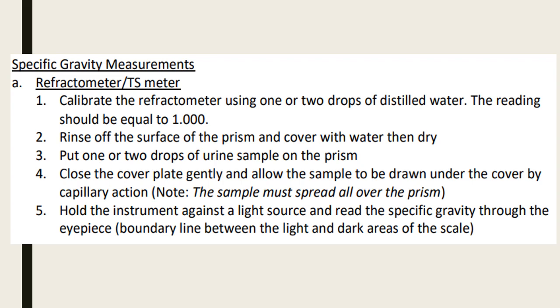Of course, your specific gravity is utilized to measure the concentrating and diluting ability of the kidneys, with its function to maintain equilibrium in the body. Your specific gravity is affected by both the number and size of particles in a solution.